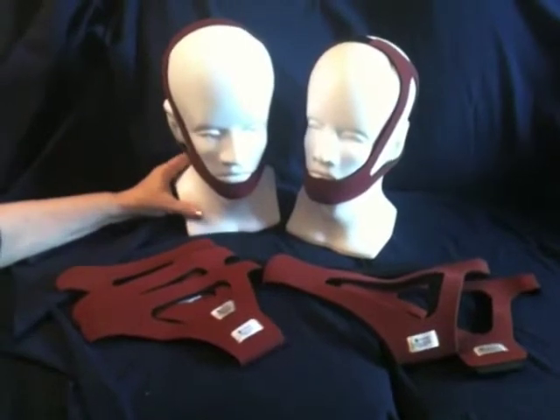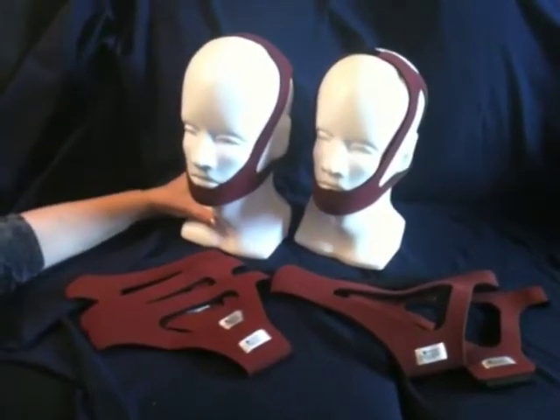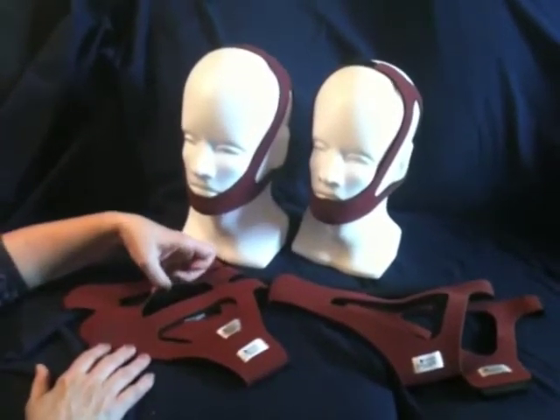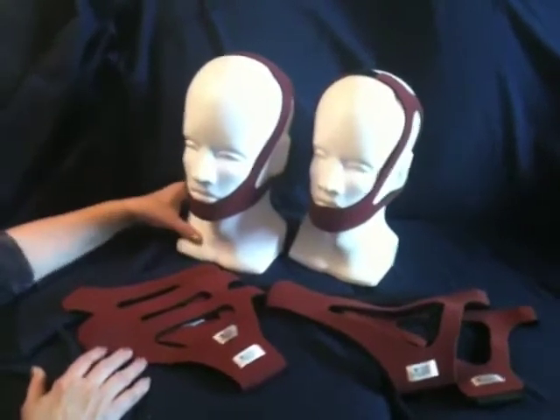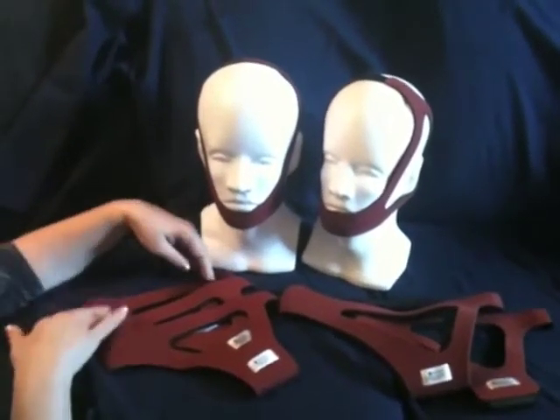The Ruby Chin Strap is designed for patient comfort and a dependable, secure fit. It's made of a fabric called Breathaprine, which also has an antimicrobial SilverTech lining that inhibits the growth of bacteria, preventing skin irritation at points of contact.